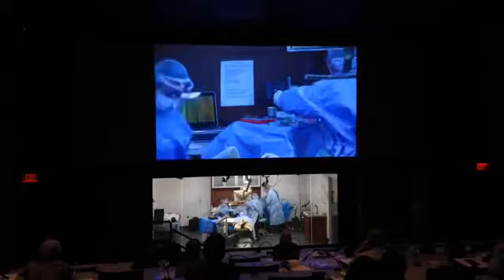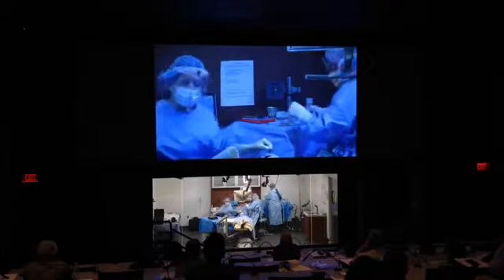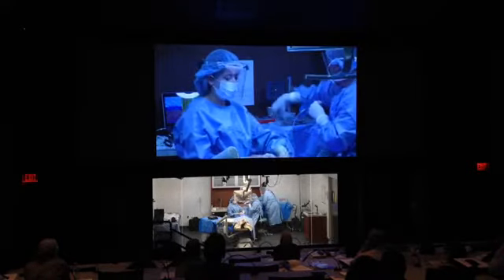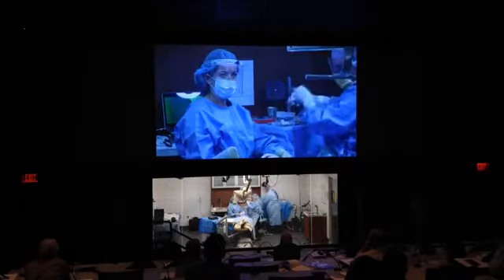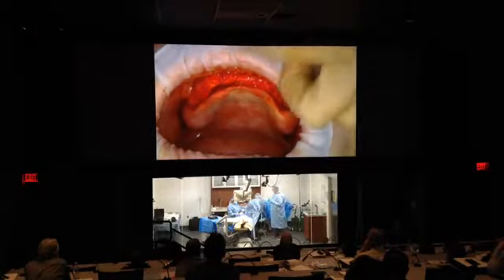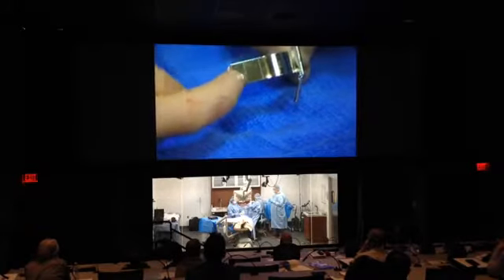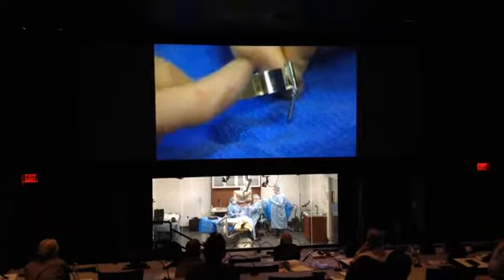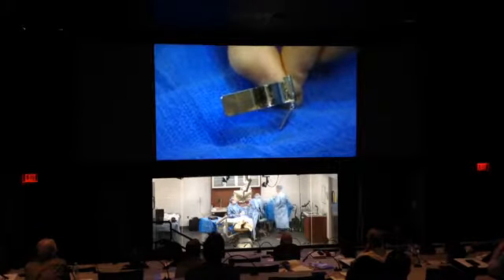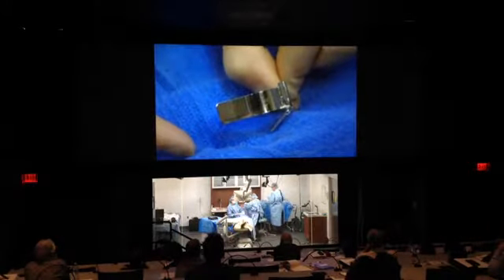Okay, so we're going to get ready to place the All-on-4 guide. What is the All-on-4 guide? I'll show you why I like to use these. Basically we're going to secure this in the midline, so it tells me where the midline is, because oftentimes when I'm in surgery I need a good location. And then we have parallel lines here, and the angle between these two lines is 30 degrees in a diagonal, or we can do 45 degrees between two lines. So it really gives me a guide for how angulated I can place the most posterior implants. Typically that guide ends around the second premolar, so I know not to go too far back.